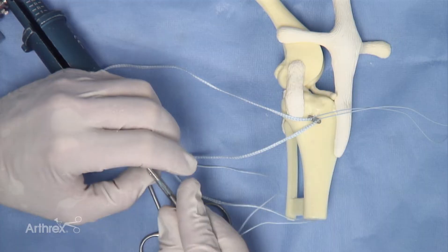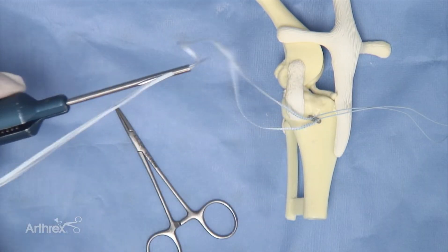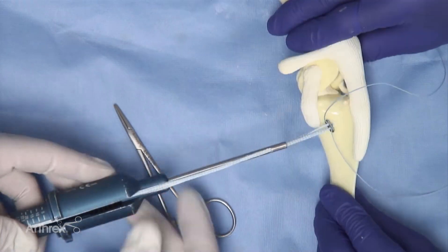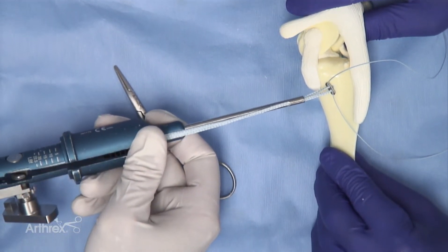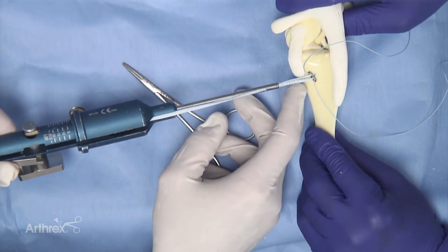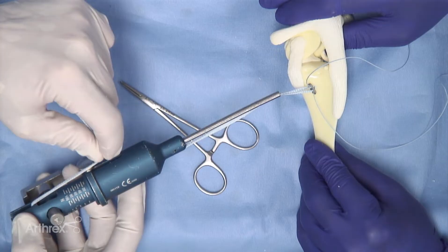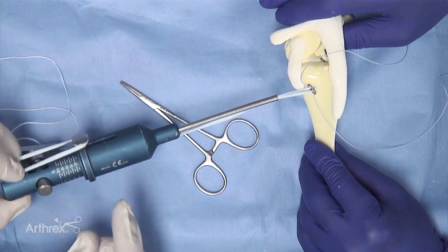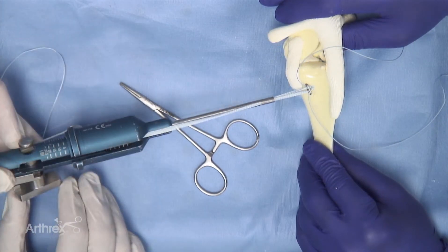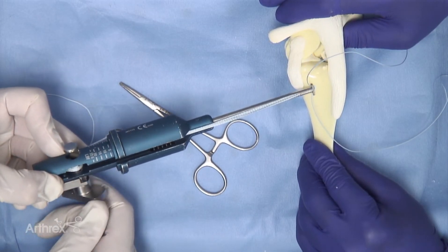The two ends of the fiber tape are placed into the tensometer. The tensometer strands are strung through the central channel and through the device that keeps them in position. We like to leave a two to three centimeter length from the button surface. These strands are then wrapped up and over the stanchion and tensioned. The tensometer can be used to create the appropriate tension of the implant.